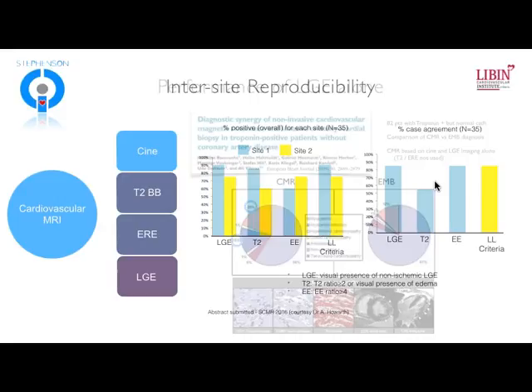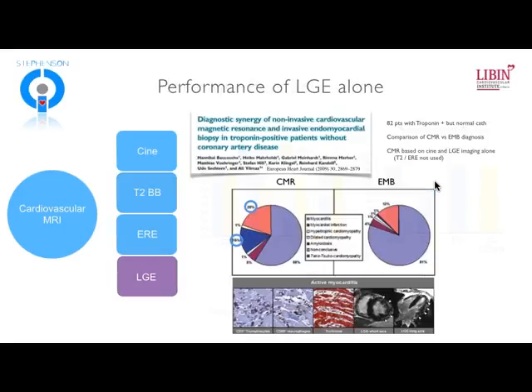However, when you look at case agreement, you see that especially for T2 imaging, there can be substantial discrepancies as to what one investigator may call as abnormal versus another. And so I think this presents some caution. And this at least behooves us to try to have more awareness that consensus criteria need to be matched by consensus agreement on how to interpret.